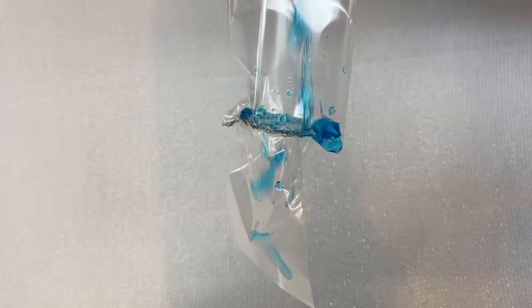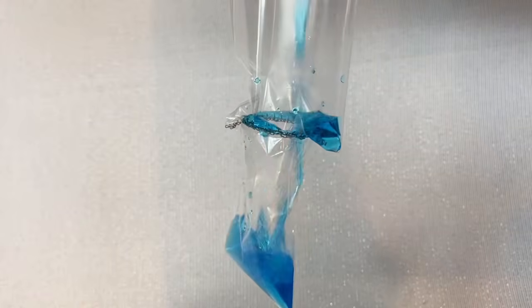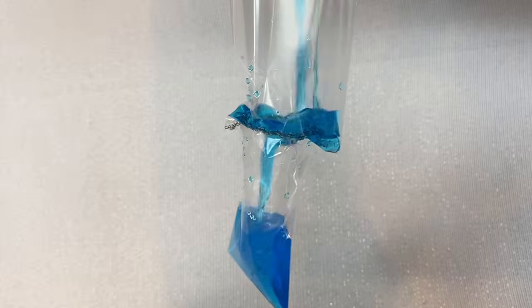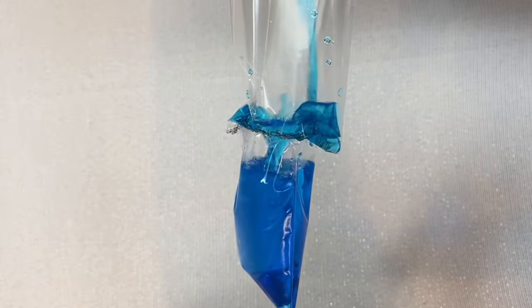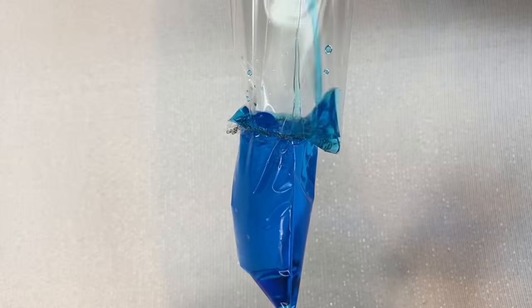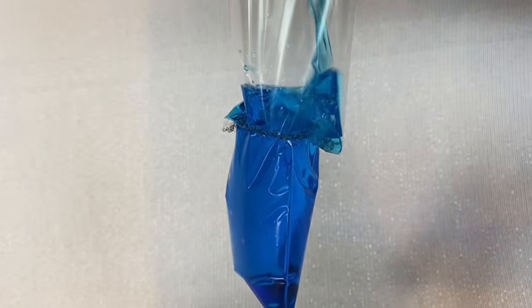Now to demonstrate how this anastomosis looks in our bag, I'm going to take that blue water again and pour it right down the center of the bag. And here you can see it flows right through and is sealed. And that's how we create an anastomosis.